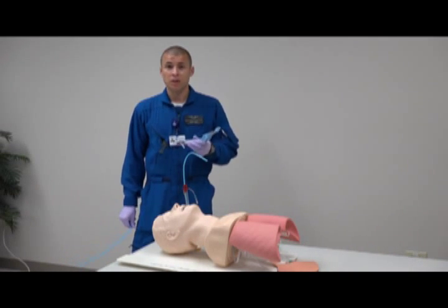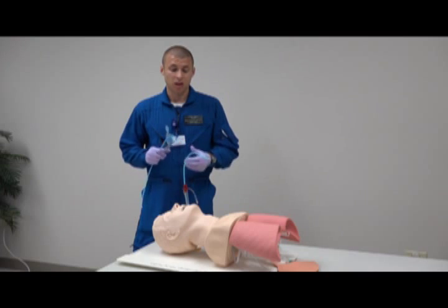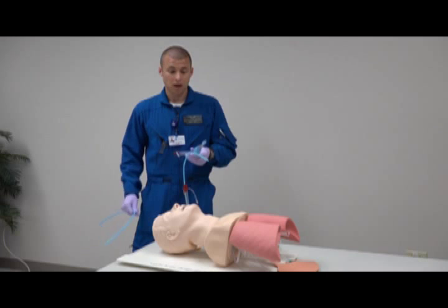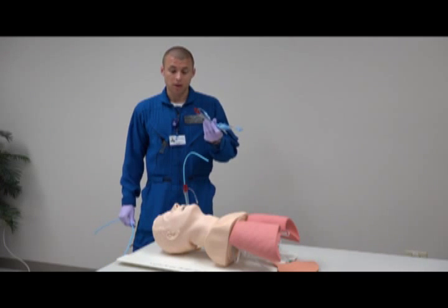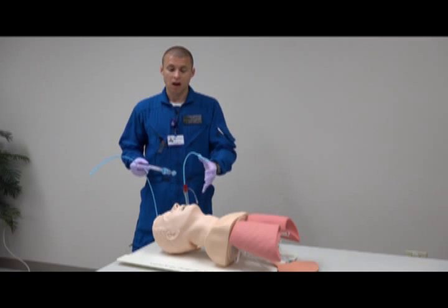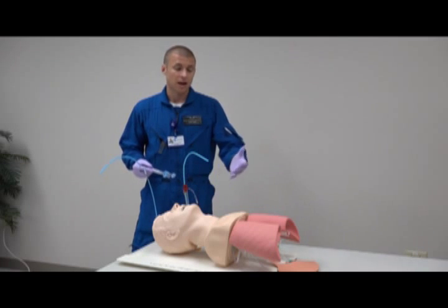Indications for needing to change out the King LTD into an endotracheal tube: if the patient has a lot of major facial trauma and you couldn't get the patient intubated normally, you go to your secondary device which would be your King LTD, and once you place that there's just been a lot of blood going into the oral pharynx.